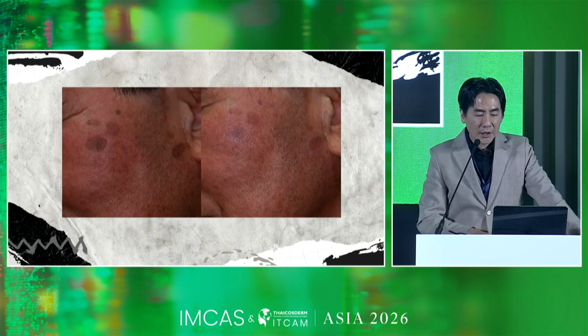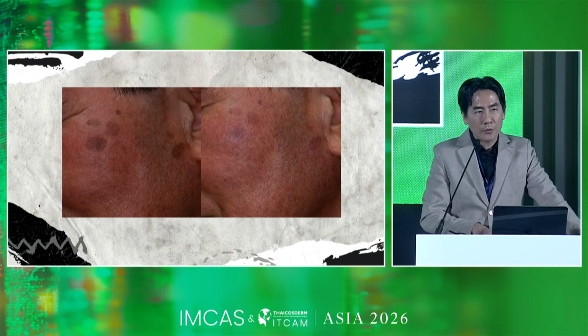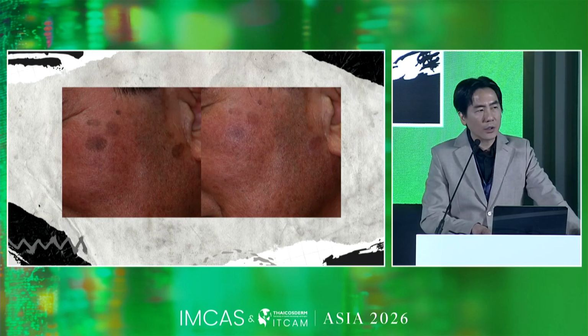So basically, I can use thulium lasers for almost all of the cases in my clinic, except when we are targeting the red chromophore, or the hemoglobin, the oxyhemoglobin chromophore. We have to use another kind of laser.